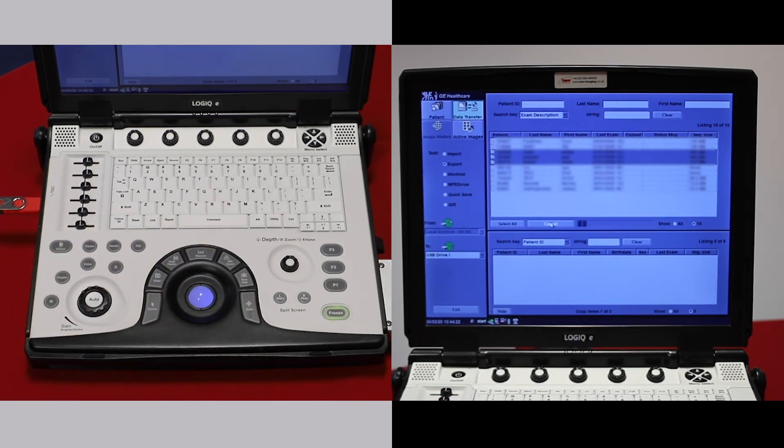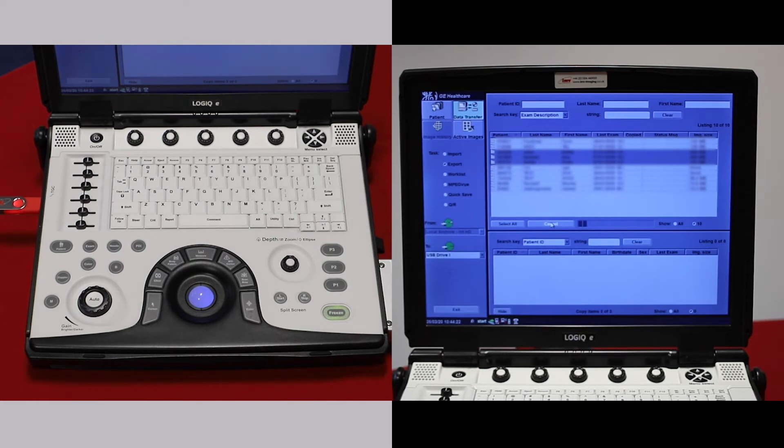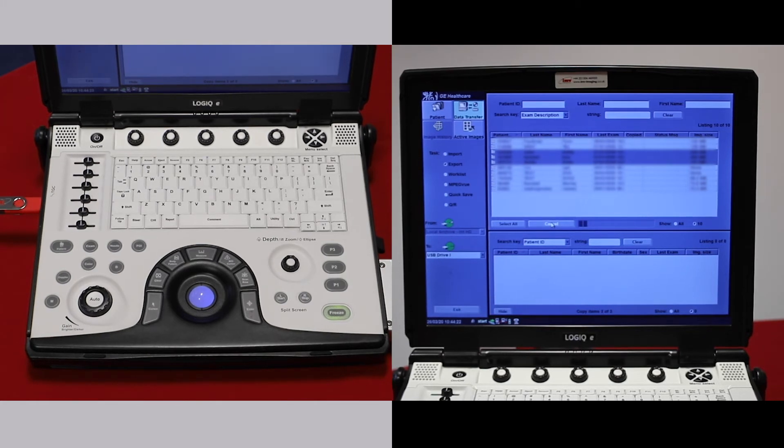This will move the images over as DICOMs. Depending on your file size, this can take some time.